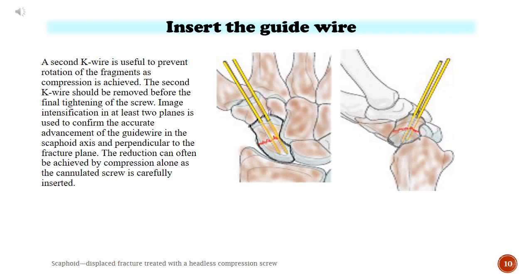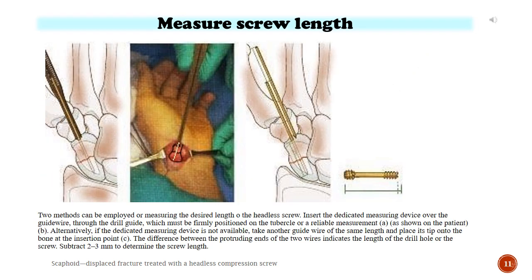The reduction can often be achieved by compression alone as the cannulated screw is carefully inserted. Measure screw length. Two methods can be employed for measuring the desired length of the headless screw. Insert the dedicated measuring device over the guide wire through the drill guide, which must be firmly positioned on the tubercle for a reliable measurement. Alternatively, if the dedicated measuring device is not available, take another guide wire of the same length and place its tip onto the bone at the insertion point. The difference between the protruding ends of the two wires indicates the length of the drill hole or the screw. Subtract 2–3 mm to determine the screw length.